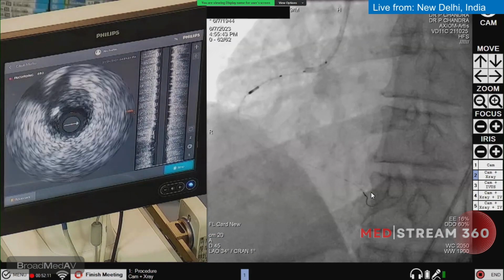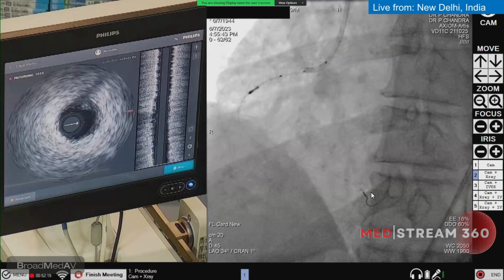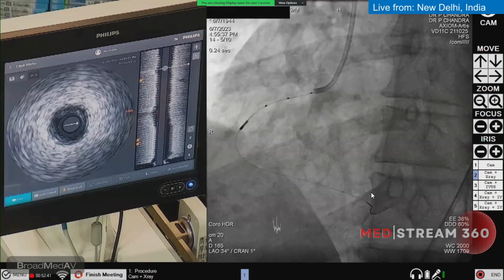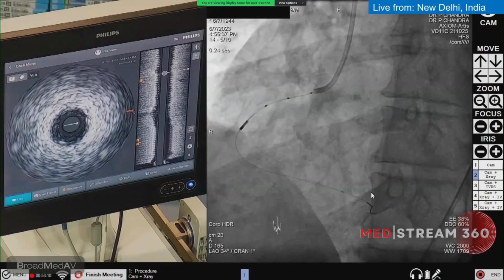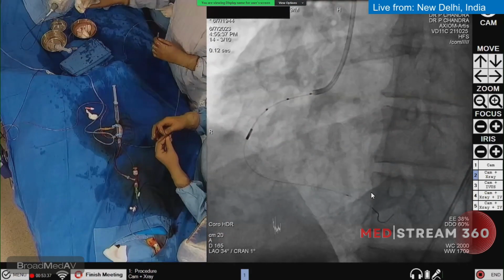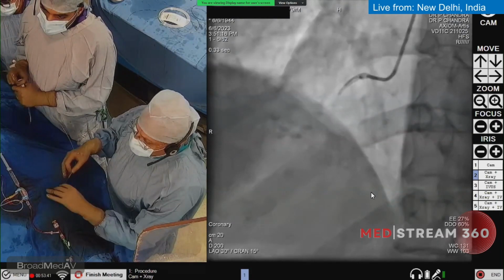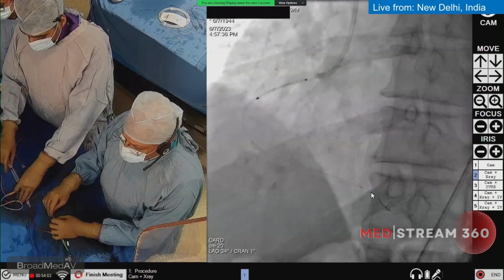You saw that calcium on the angio also. And we see it here also, eccentric calcification. Previous IVUS run. Okay, fine. So it looks like 2.3, I think. 3 by 23 stent, please. Why are we doing so? Because each marker is 10 millimeters and the distal imaging part is 2.5 millimeters. This will be the time when we will give 1 ml of diluted contrast.